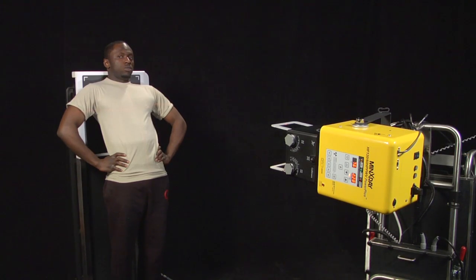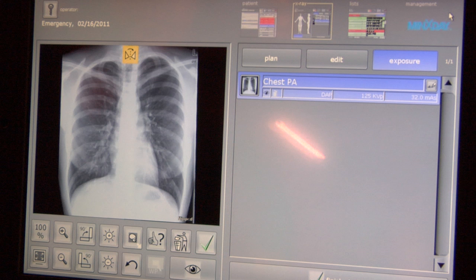Make the exposure when the green light on the bottom left of the exposure screen is on by pressing and holding the exposure switch until an audible beep is heard or transmitting as seen on the screen. Once the image is on the screen, select the green check mark under the image, then select the green check mark on the bottom right of the screen to finish the study.